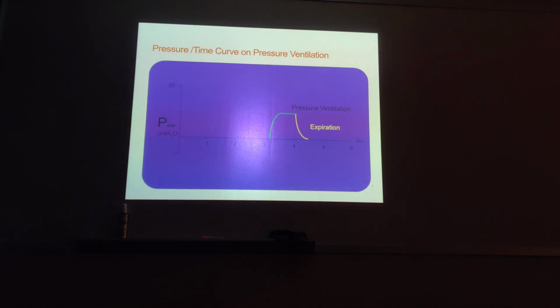But either way you go, the pressure is going to have to go to the set value and then stay constant throughout the time for inspiration before the patient exhales out.